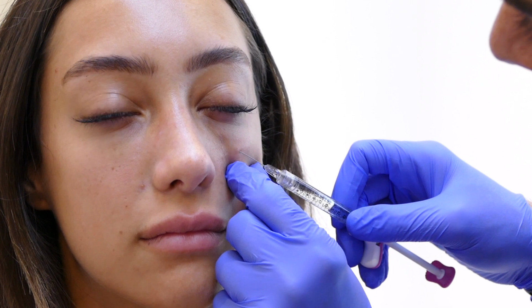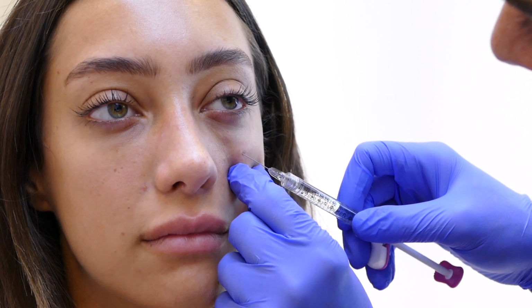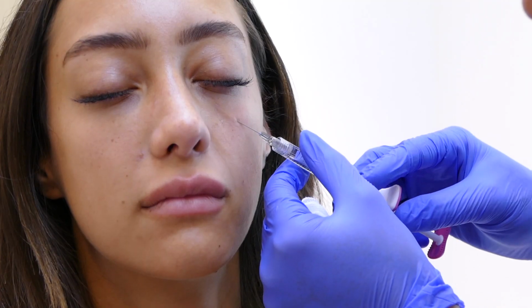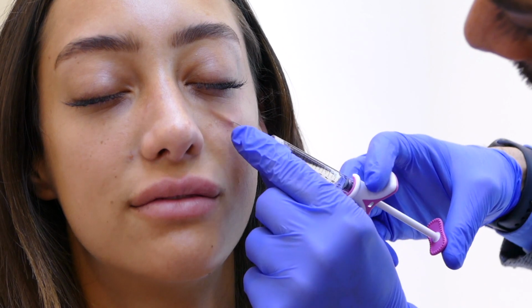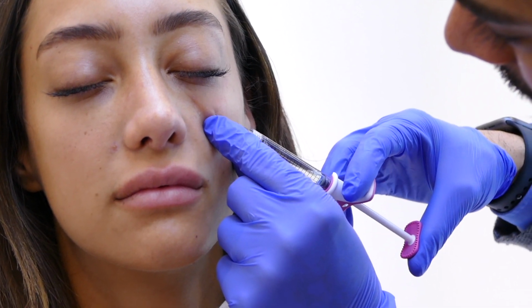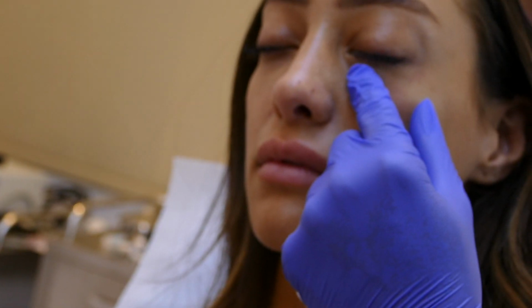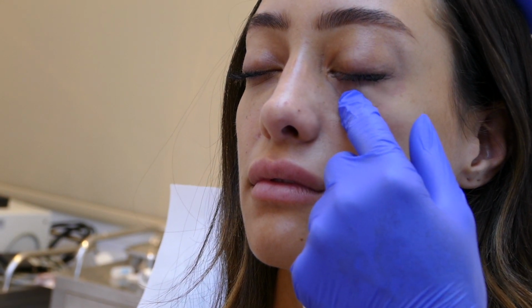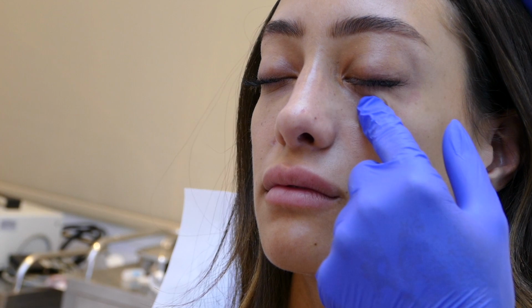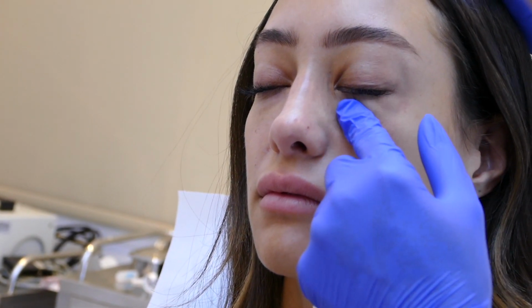After a needle puncture with 26G, a cannula is inserted, which is 27G, carefully placed underneath the muscle over the periosteum. It is guided with the other hand, and then the filler is placed in small quantities in a retrograde fashion just underneath the muscle over the infraorbital rim. After the placement, it is gently massaged to spread the filler and to avoid lumpiness.